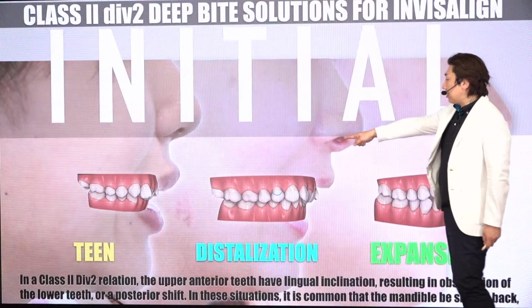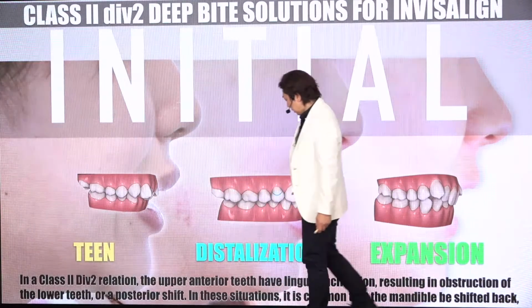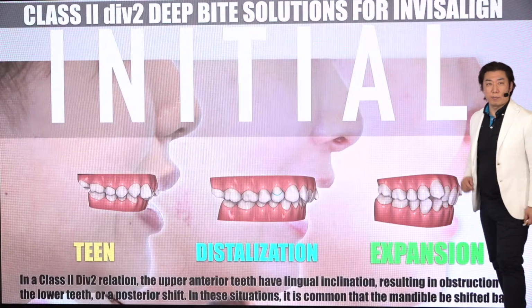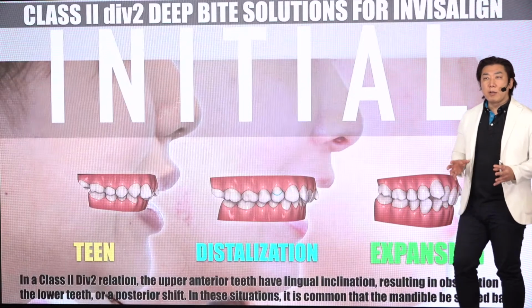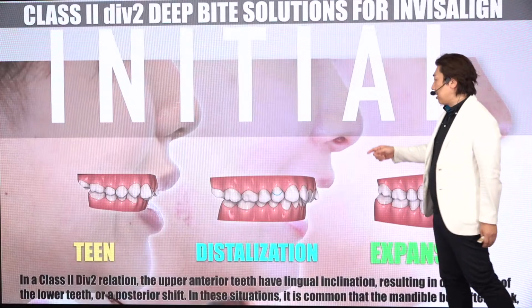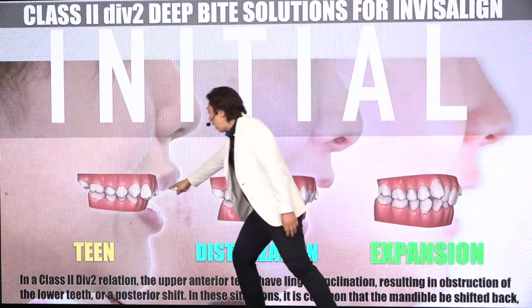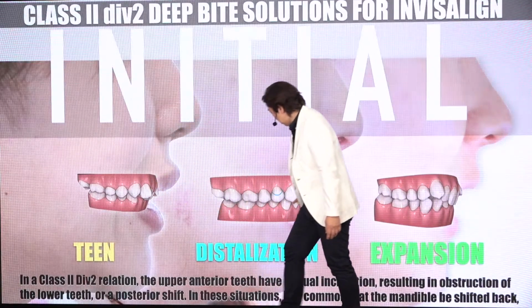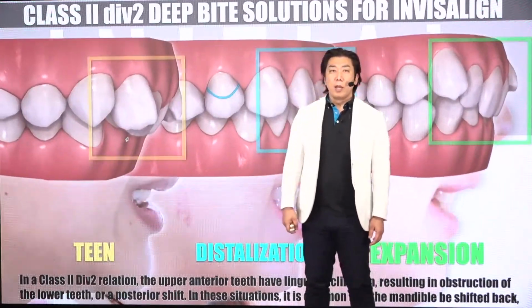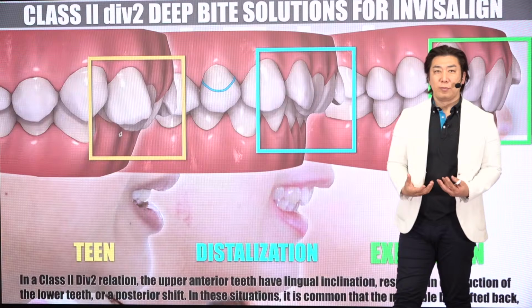Then this is a ClinCheck, right? As you can see here, same anterior teeth position. Every single patient has a different tooth position, guidance, tooth size, everything is different. But the approach is almost focused on how we can prevent this tooth angle. This is a very important thing. Initially, how can we approach it? This one.